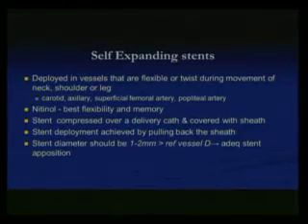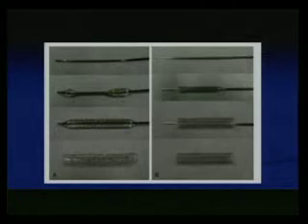And in balloon expandable stent, you use the same diameter vessel, same size stent. For example, it's 5 millimeter, use 5 millimeter. And self-expanding stent always go up 1 to 2 millimeters. So we talked about the balloon expandable stents. This is the mechanism. It's mounted on a balloon, and once you get to the lesion, you inflate it to the nominal pressure, and this is how it looks when it's expanded. And this is a self-expanding stent. It's placed on a sheath, you unsheath it, and this is a self-expanding stent.